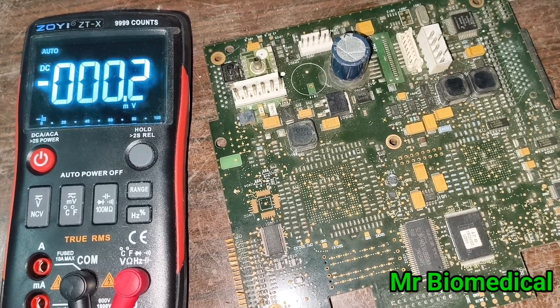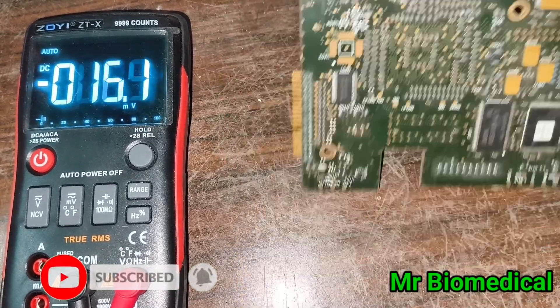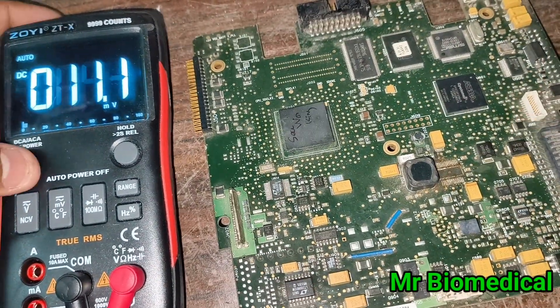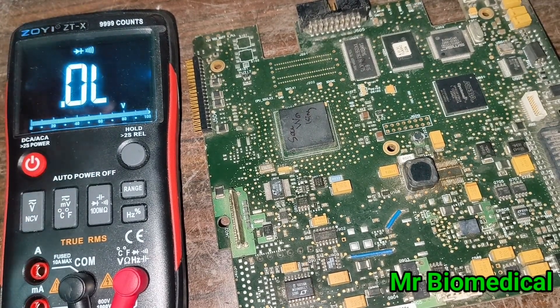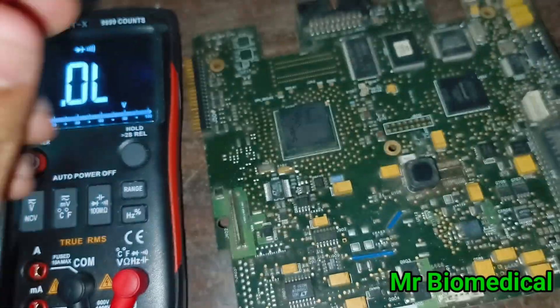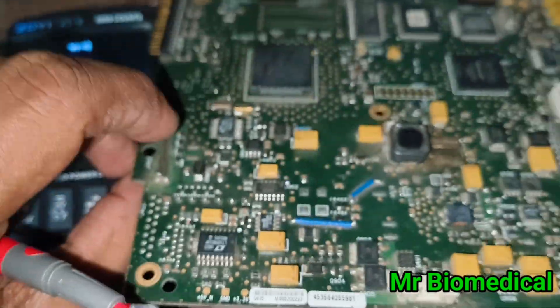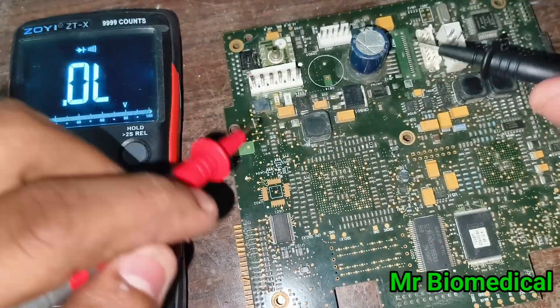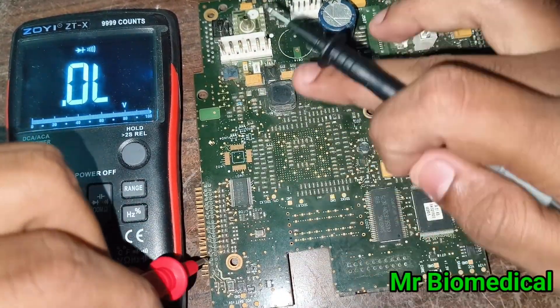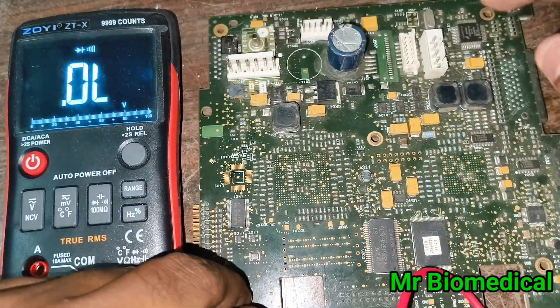Today we're going to look at SMD boards and their components. Put your multimeter on continuity mode. When you are working on medical electronics SMD boards, like this Philips main board for example, the first step is to make sure where the ground is — that the ground is properly connected to the common pins.